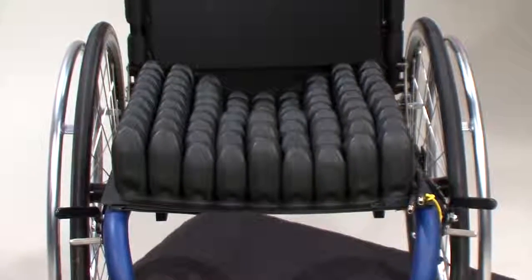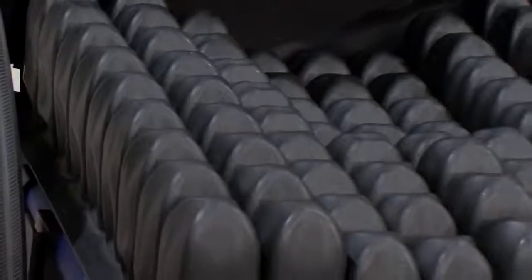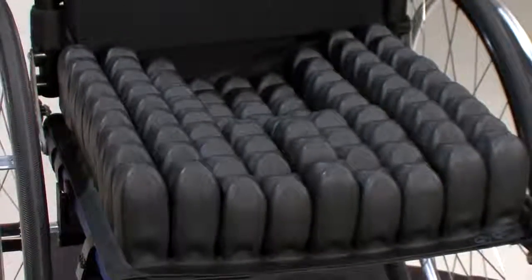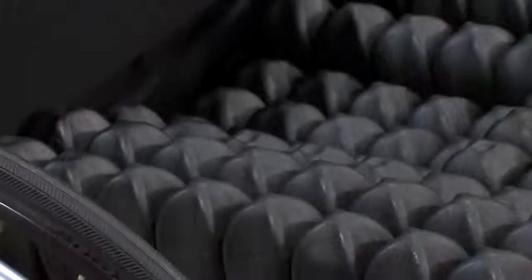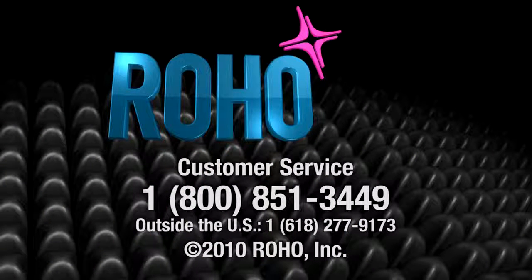Completing this Roho Cushion Series is the Enhancer Cushion. Constructed of varying heights of cells, the contour design allows a greater level of pelvic stability. For adjustments, follow the instructions stated previously for multi-valve cushions. For more detailed information regarding these cushions, please click on the product information section on this webpage or call customer service at 800-851-3449.